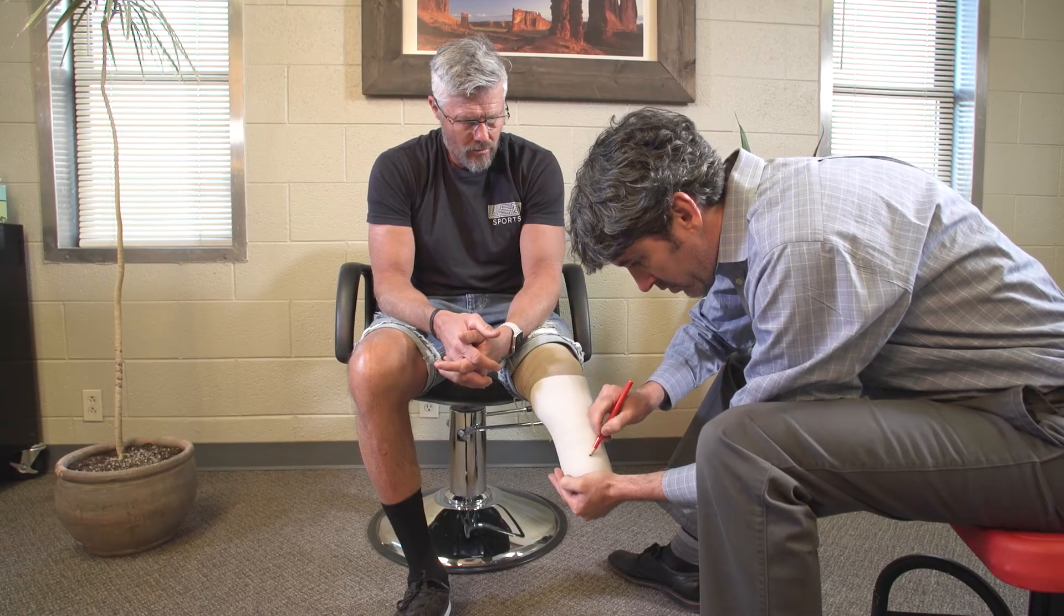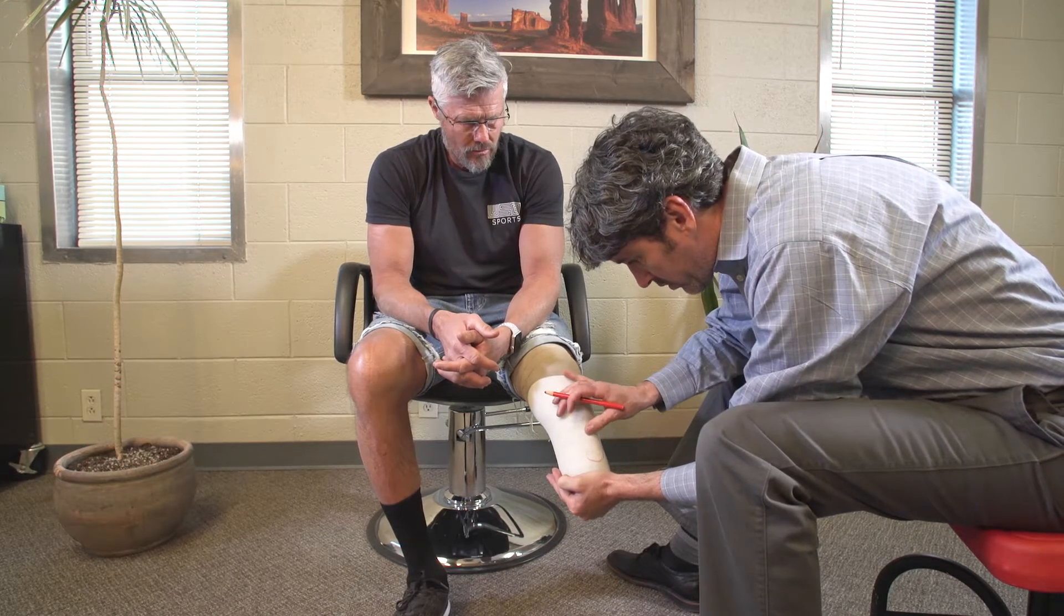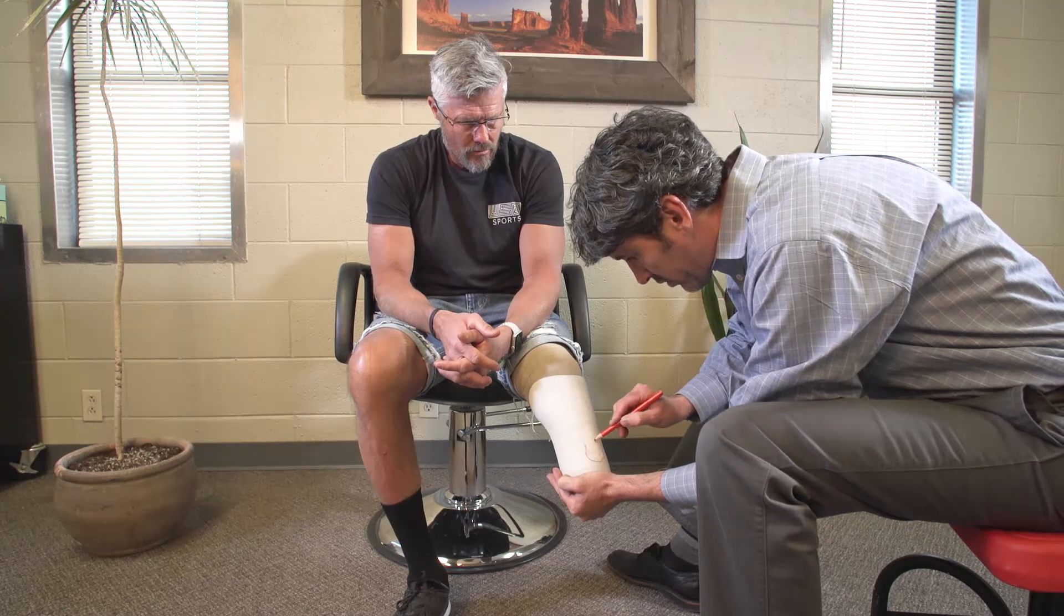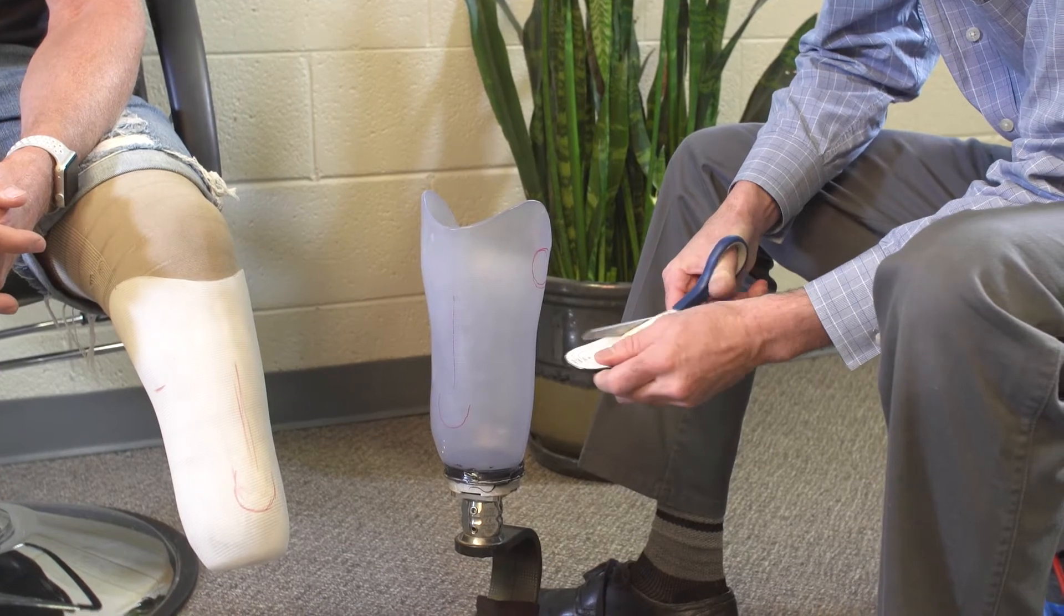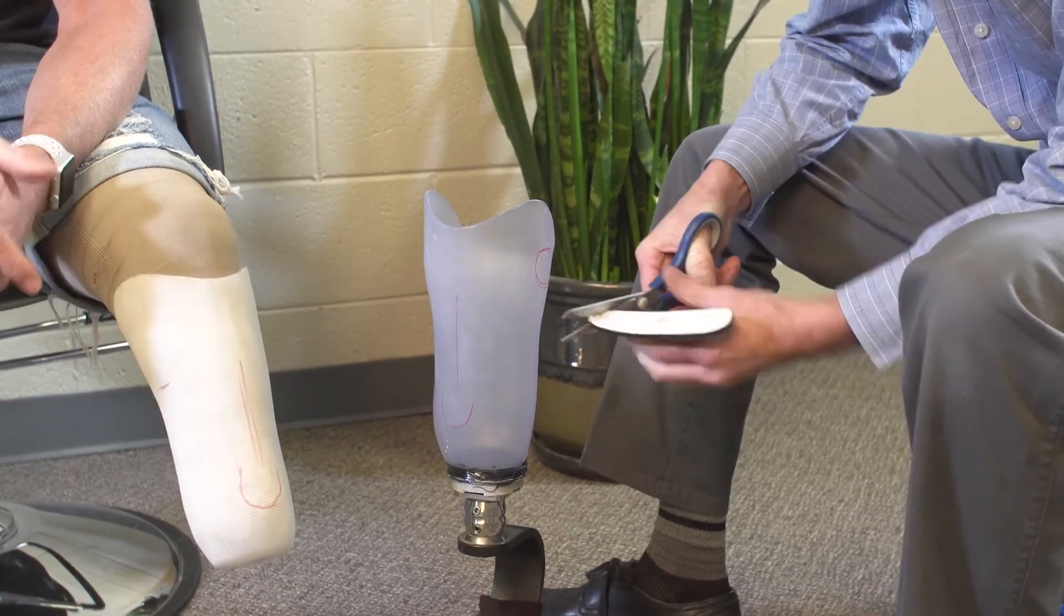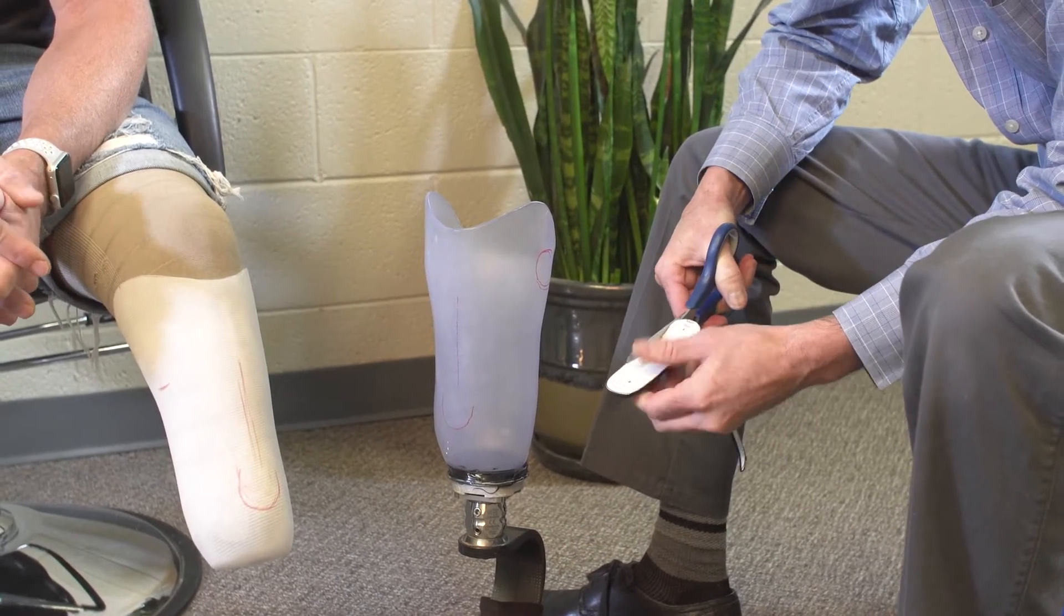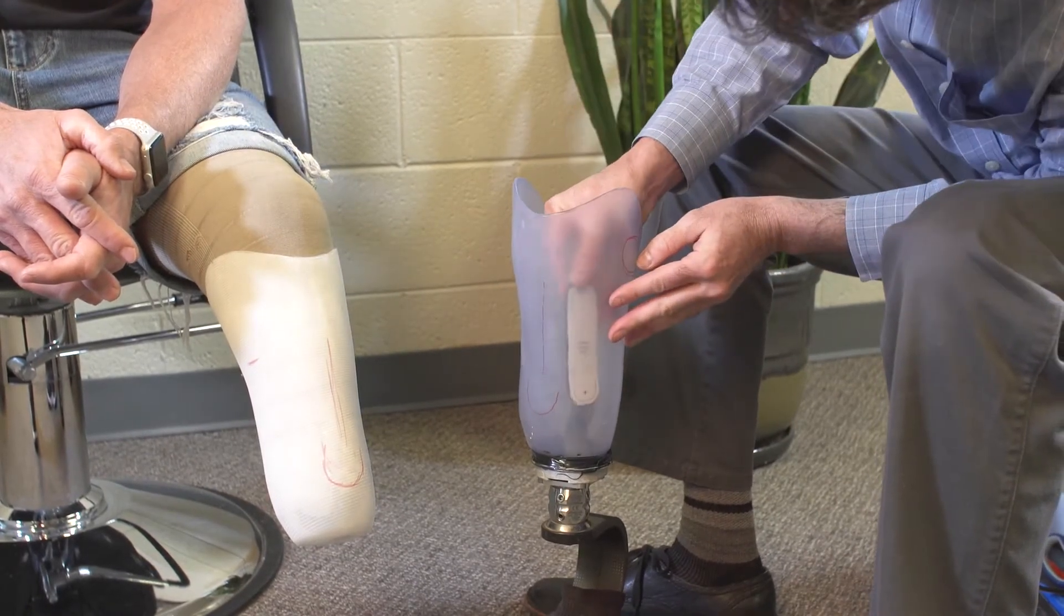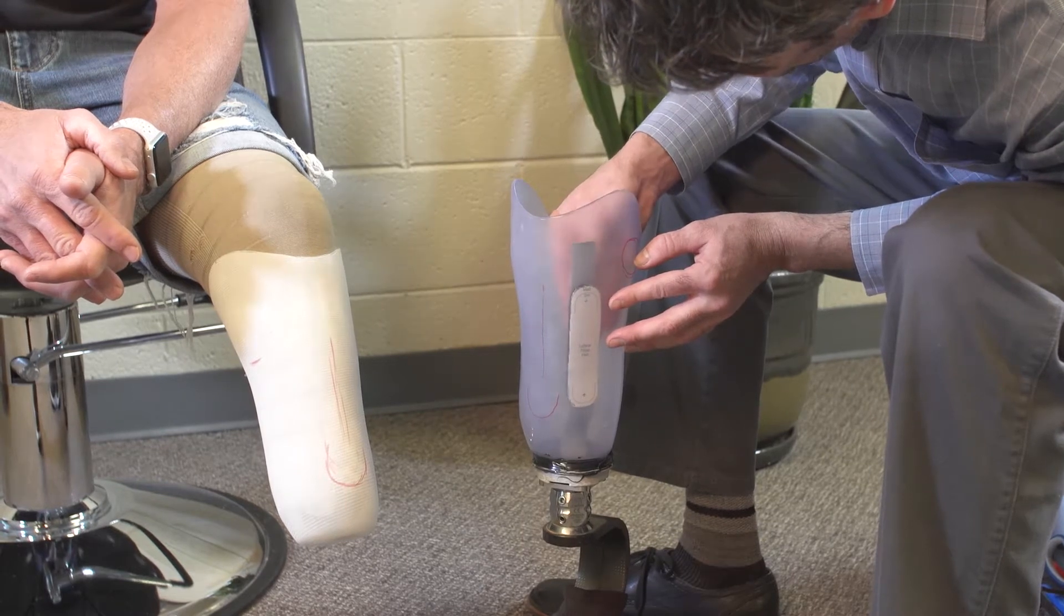Panel positioning really begins by marking the bony protrusions on the flexible insert. These markings will show you the places to avoid when finding your panel placement. To help with panel design, we supply pre-shaped pad templates in the check socket kit. Adhere these to your padding material, and then trim to size and skive the edges. Then, the panels are located one by one by taping a pad on the inner surface of the check socket in its likely location.